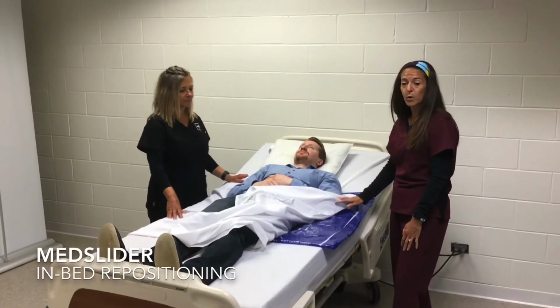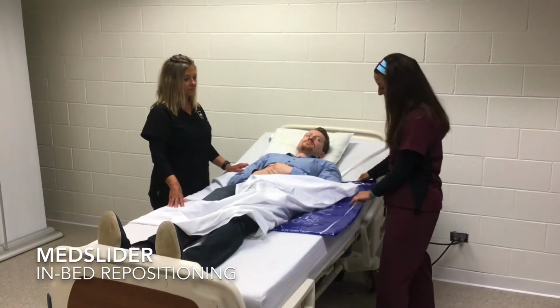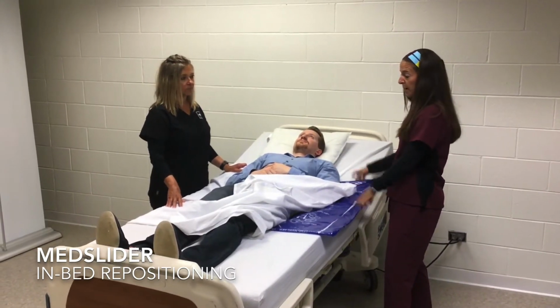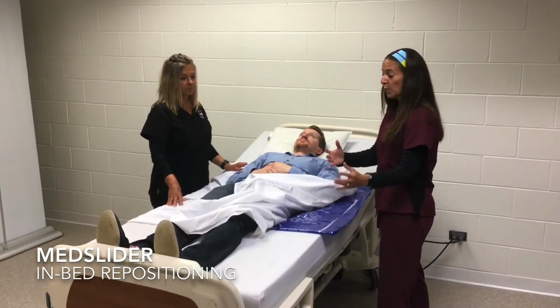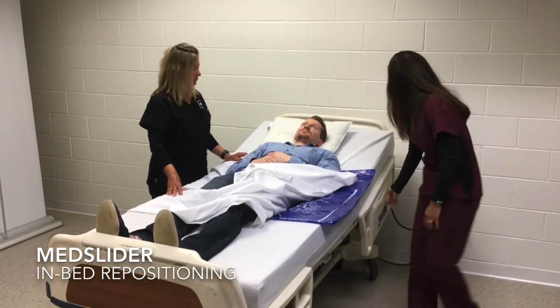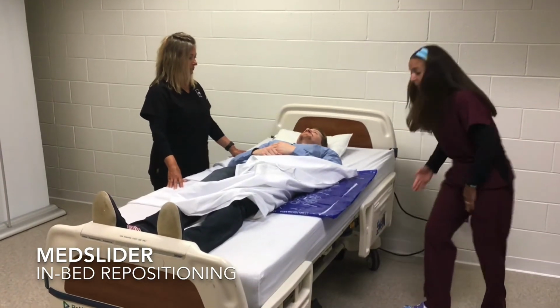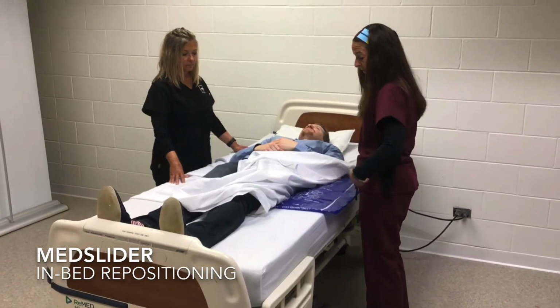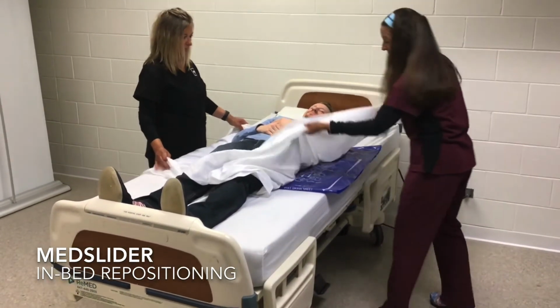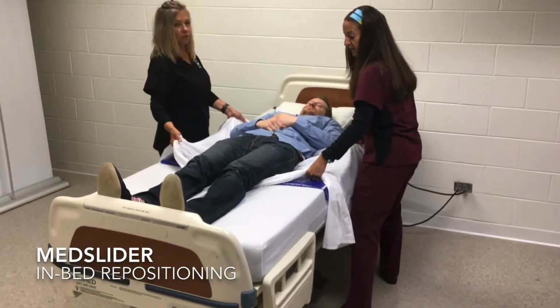So in this example, we're going to boost the patient up in bed. We've already applied the MedSlider, and you can see the arrows show the direction we're going to pull the patient. In this scenario, our patient has slid down in bed, so we need to boost him back up. Right now, the head of the bed is up, so we wouldn't want that. I'm going to flatten it so that we can reduce the workload on our back. And then we want to make sure that the bed is about our waist or hip level. So now myself and the fellow nurse are going to boost him up in bed using the MedSlider. Okay, here we go. 1, 2, 3.